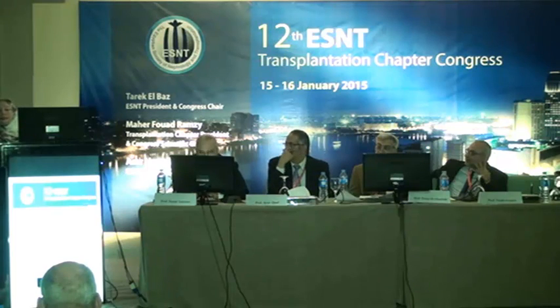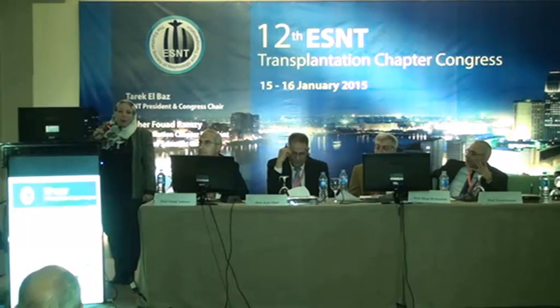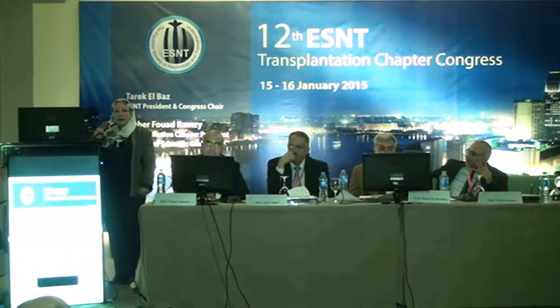I have a question. What I understood is that CDC cross-match means complement dependent cytotoxicity. But if we have non-complement dependent antibodies? The most important antibodies are the antibodies that activate the complement. Yes, but we now have IgG3 first and then IgG1. Yes, because IgG2 is less activating and IgG4 is not.